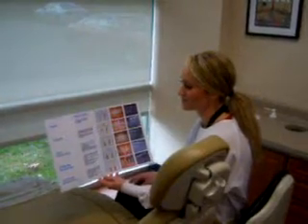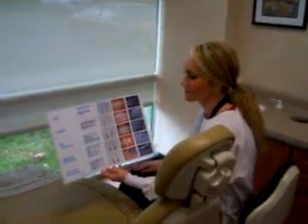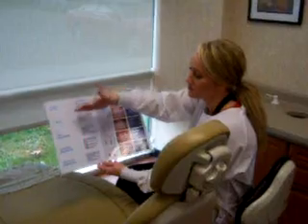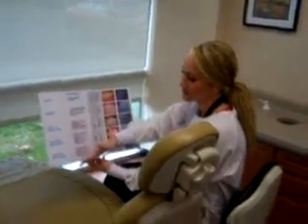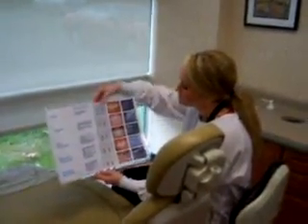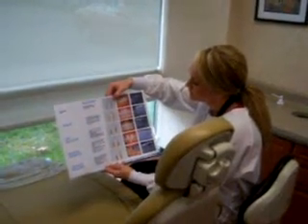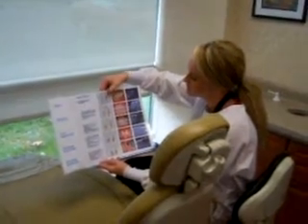I'm going to be screening you today. Just like we discussed earlier, I'll screen you whether you're healthy, whether you have gingivitis or periodontal disease. And how I go about doing that is I use this instrument — it's called the probe, and it's actually calibrated by millimeters.